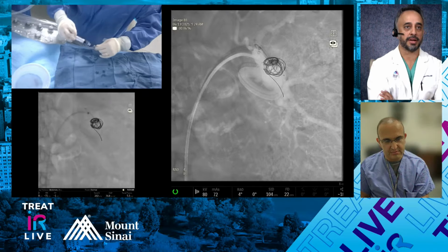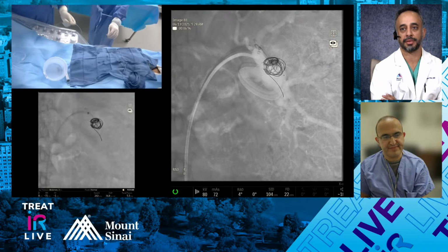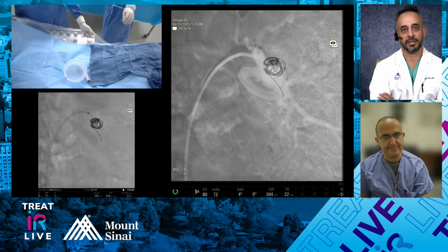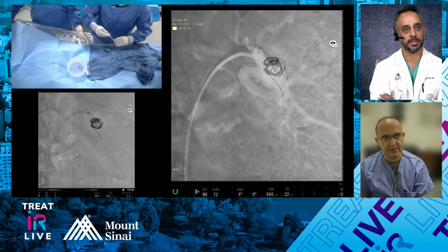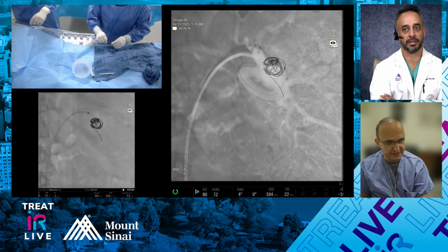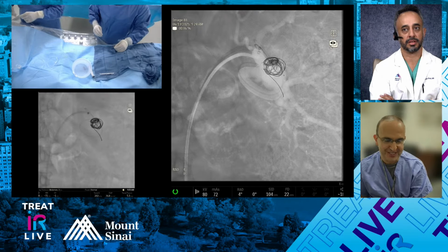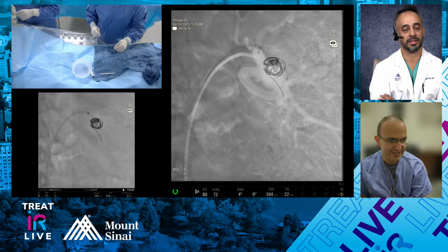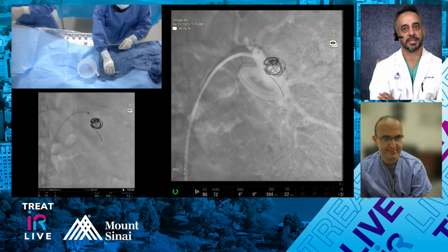In terms of microcatheters, as you said, your catheter's buried in there. I kind of like the dual marker catheter systems, because at least you know where the detachment mechanism is going to come out, right? I'd like to emphasize the nitinol wire is very useful. Usually it's just the fellow, but if they're really aggressive about pushing it in, you bend that proximal part and it gets really hard to push the rest of the coil in through the catheter. It kinks, or you get premature detachment, especially with some of the coils. Yeah, so it is nice.